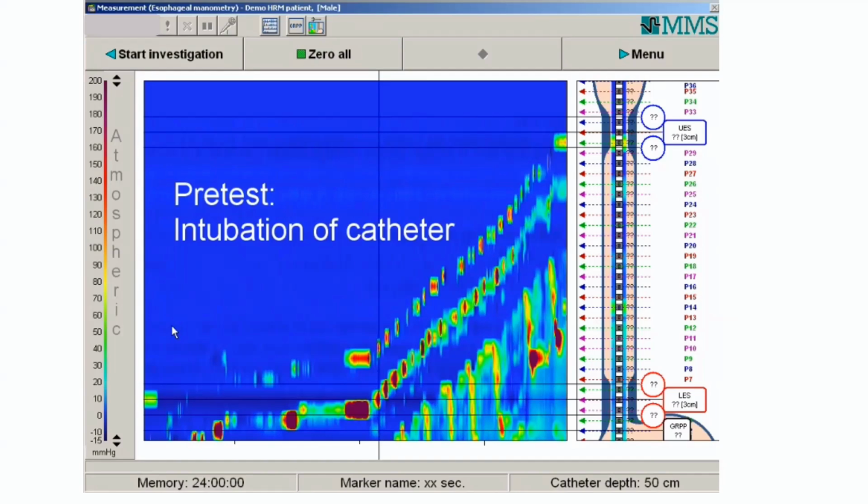It's very easy and it should be done before each procedure. From time to time, like every 6 months or 8 months or 1 year, depending on the load on the catheters, we have another type of calibration. It's more technical. It should be done by the service team. But before each procedure, it's very easy. Just hold the catheters, then press zero all, and it will be okay.